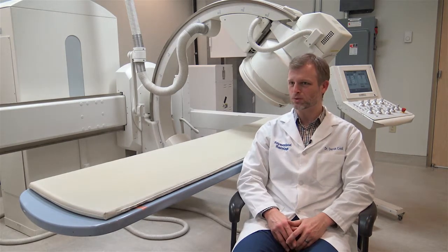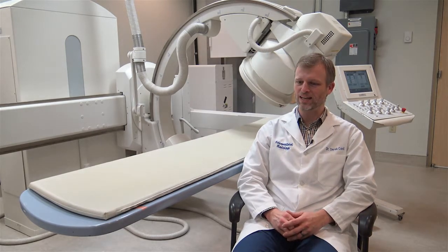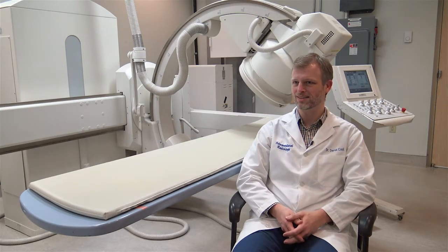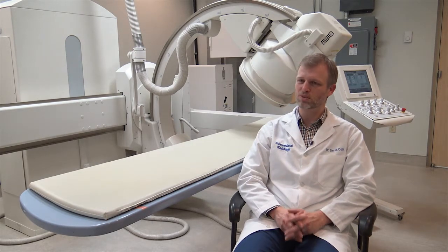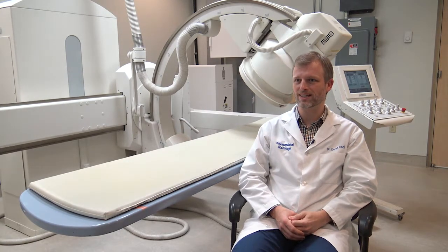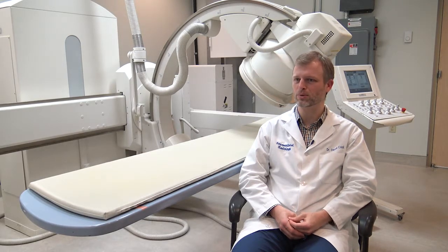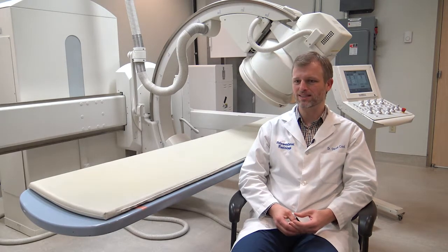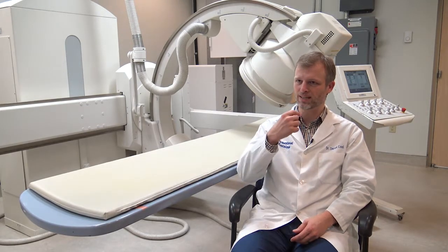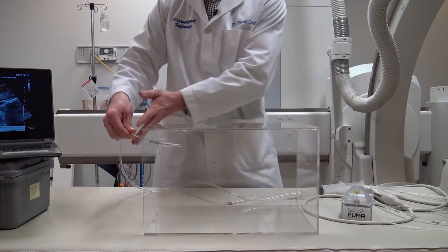The percutaneous ultrasound gastrostomy technique, or the PUG technique that we've trialed, is a unique technology in that it allows us to put in these effective gastrostomy tubes just using ultrasound on its own. We use a standard gastrostomy tube that the gastroenterologists would use when they do an endoscopic insertion, but instead of having the camera put in the mouth down in the stomach, we place a balloon that has a magnet on the end, and we feed that in the mouth, down the throat into the stomach.